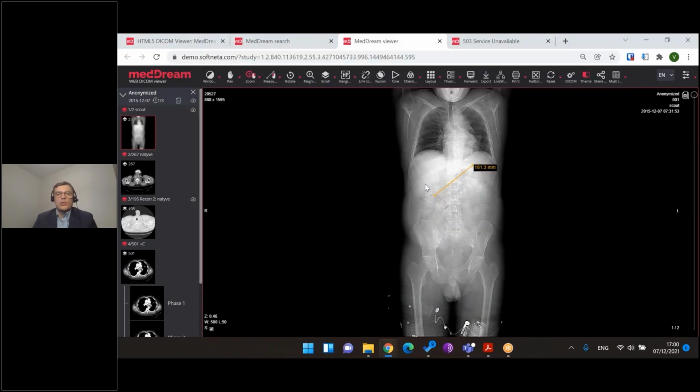So your engineers need to connect with our integration department to discuss the possibilities to use these features and how to transfer the measurements to the reporting. Another very important change, if we speak not about visual things, is how our studies could be prepared. So you also need to contact us and check the settings in documentation, because a lot of new things are coming. For example, if you are working more outside of a hospital and your users always need to preload studies to the computer, we are introducing a new way of communication where our system zips data in the backend and sends only zips to the user.